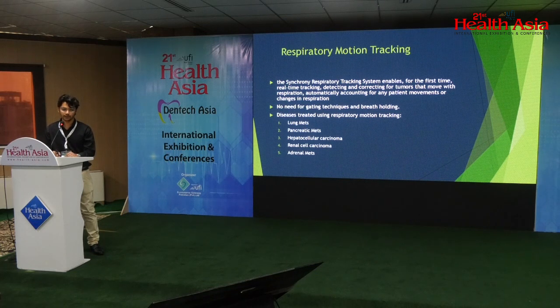The most challenging aspect is how do we accurately track the patient, the tumor, and make sure that the radiation dose is delivered to the tumor only. A lot of you should know that in CT and MRI we use gating techniques to study the respiration of the patient. In Cyberknife, we don't need respiration gating techniques because the average treatment time lasts about 45 minutes. So it is not practical for the patient to hold their breath for 45 minutes.